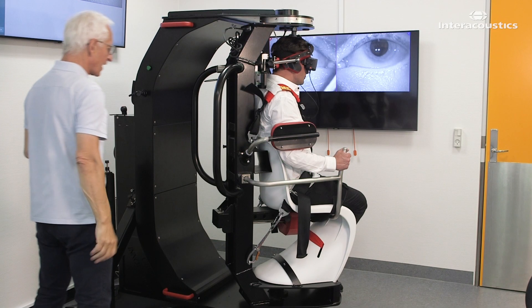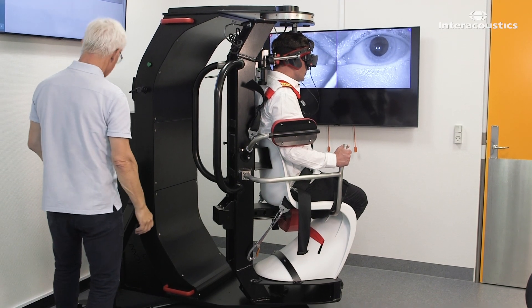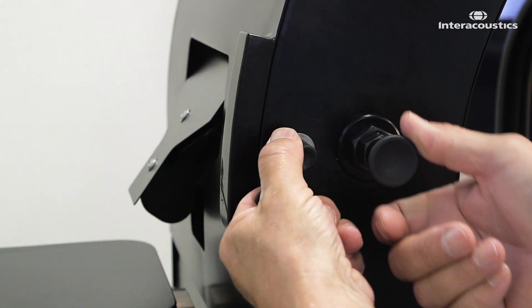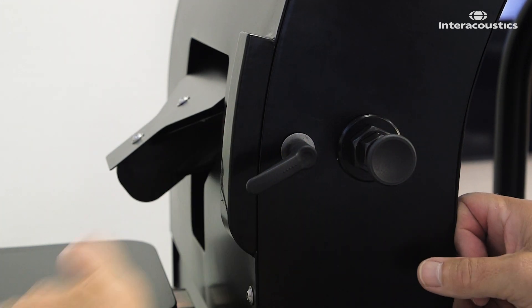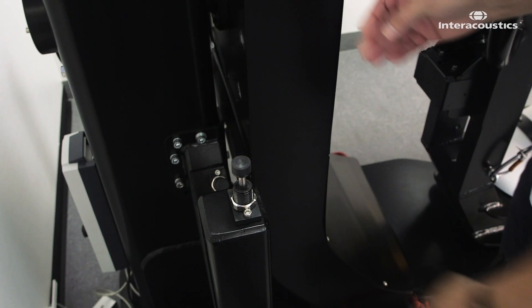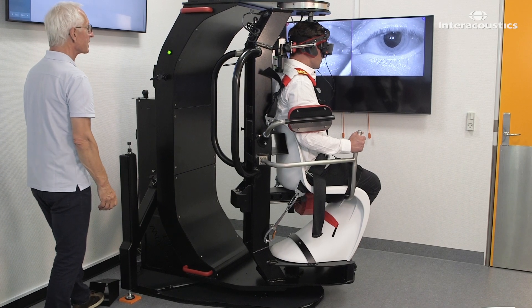This is how you perform a potentiated Epley maneuver in the TRV chair. First, lock the augmented stop arm at the back of the chair in a 45-degree downward position. This arm will collide with a lower shock absorber to stop the chair in the correct position.